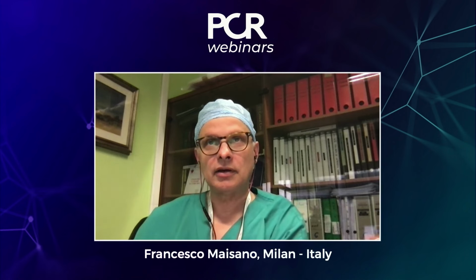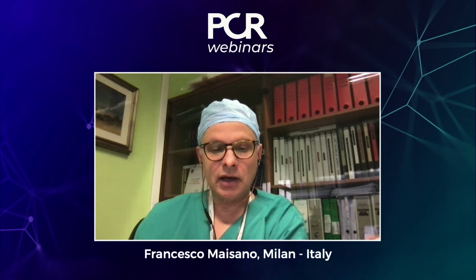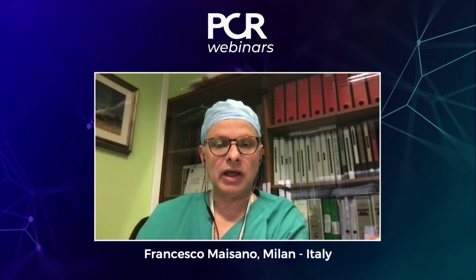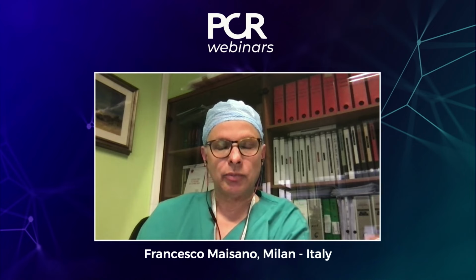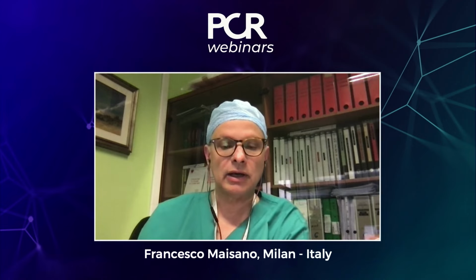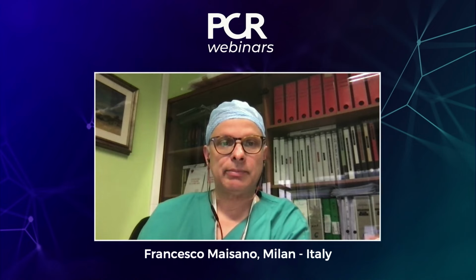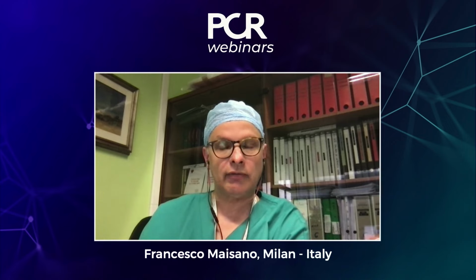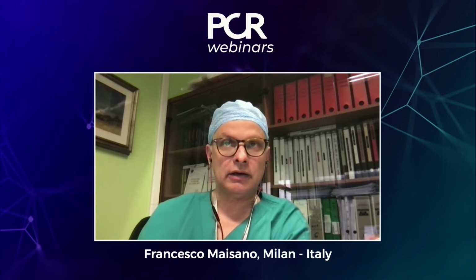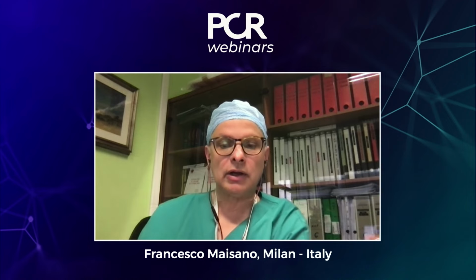Yeah, so Lars, it looks like we don't speak enough together about our best practice, but we do exactly the same. So I use exactly your technique. I think what is important for the audience, you did a good predilation with a proper balloon, which is performing pretty well. And I think it is fundamental for this device to have a prepared anatomy. You use the cusp overlap approach, which I think today should become a standard, at least for Evolut and for the Portico family overall.